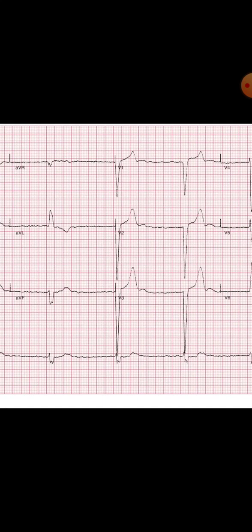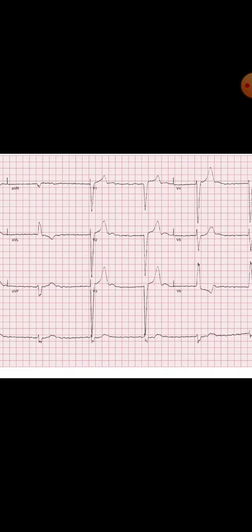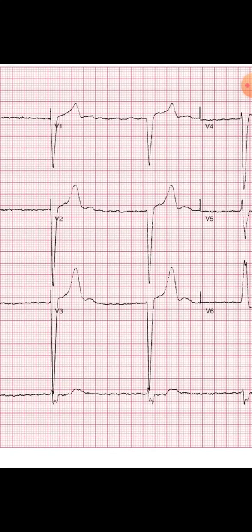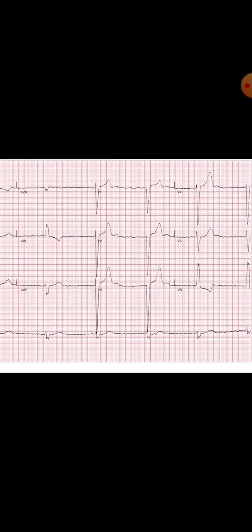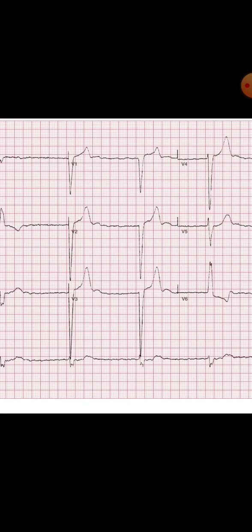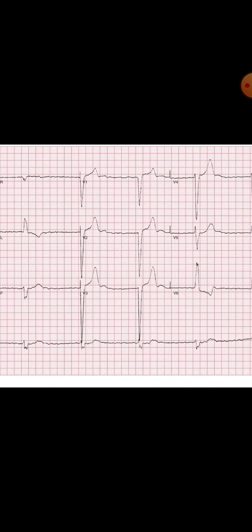But what about the QRS complex morphology and the rhythm — is it regular or irregular? It's evident that the QRS complex is broad, more than 120 milliseconds, almost 125 to 130 milliseconds wide. And there is a regular RR interval. As we know, in atrial fibrillation the rhythm is irregularly irregular, but here it's regular — so what does that actually mean?